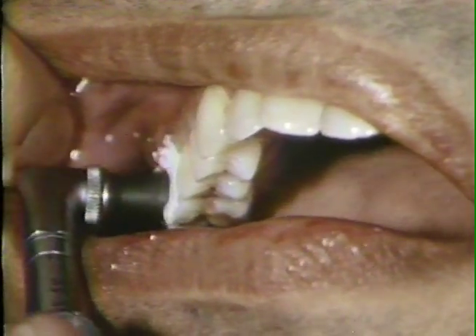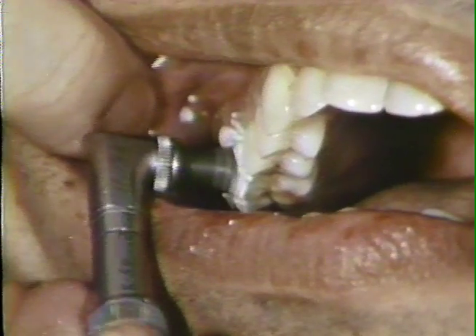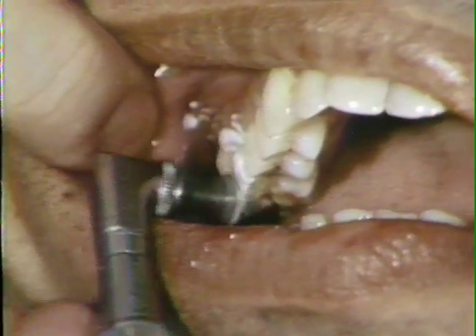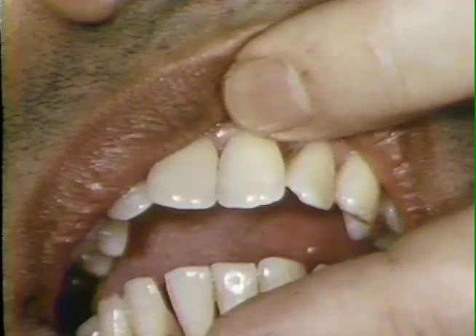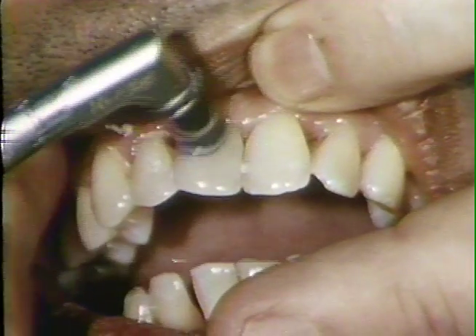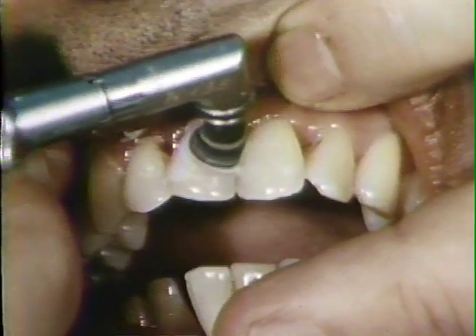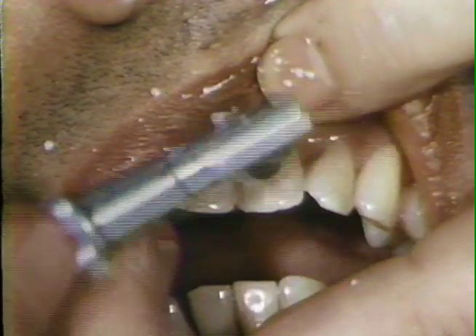A contra-angle holds the rubber cup, which is filled with polishing paste. This is used on all the teeth. The thin borders of the rubber cup make it possible to polish slightly under the free gingival margin of the teeth, as demonstrated here in the anterior region.